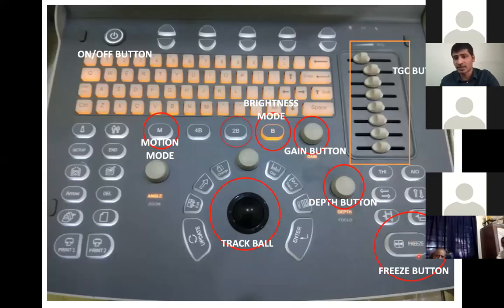This is the freeze button. If we need to freeze the image and do a measurement, we need to use this button, because on a moving image we cannot measure the organs. This button freezes the image that we are looking at, and this is called the trackball or trackpad, to facilitate the different types of work we do on the still image.